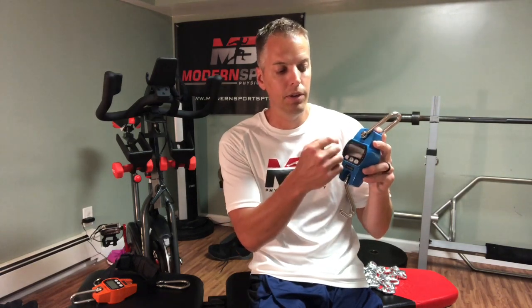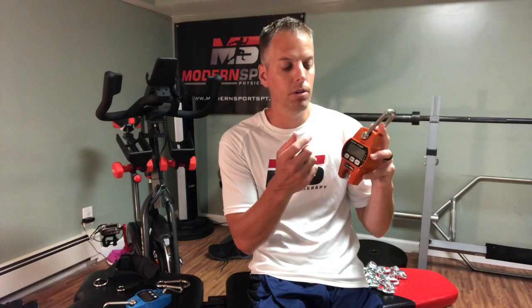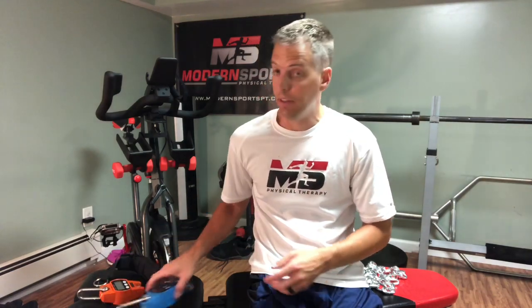When somebody kicks out, it'll keep the highest number on the screen. The cheaper model doesn't do that, and I made the mistake of buying that one first. It doesn't keep the peak hold feature, so I had to video the screen and then go through the video slowly to find the peak number and write it down. So spend the fifteen extra dollars and get the one with the peak hold feature — it's really that much easier.